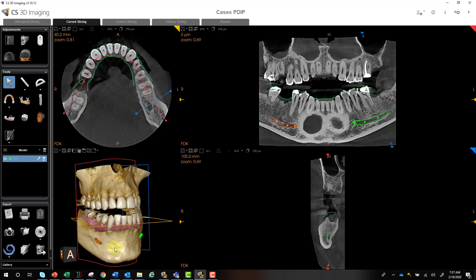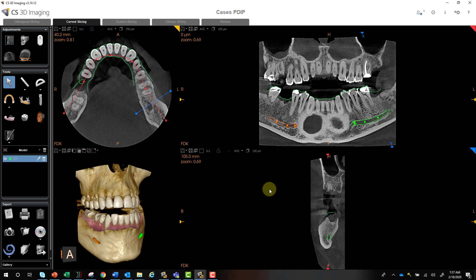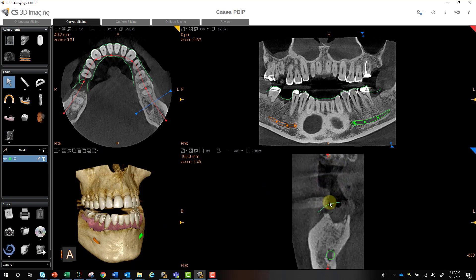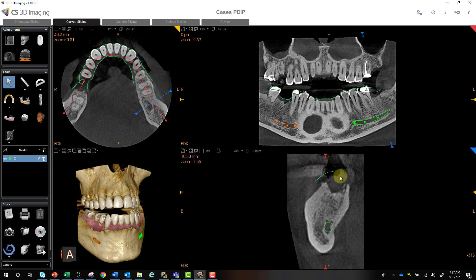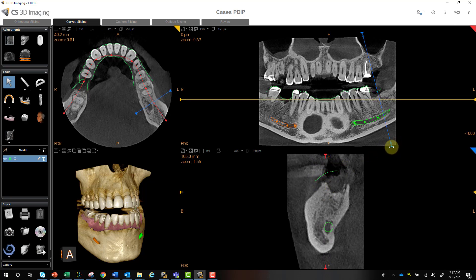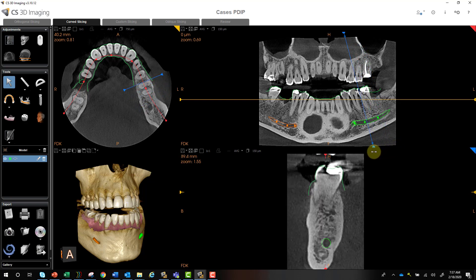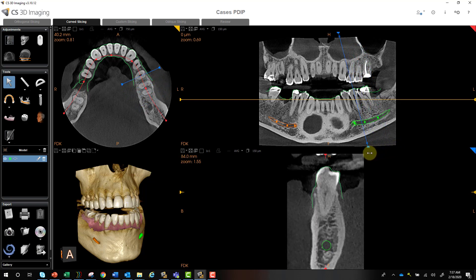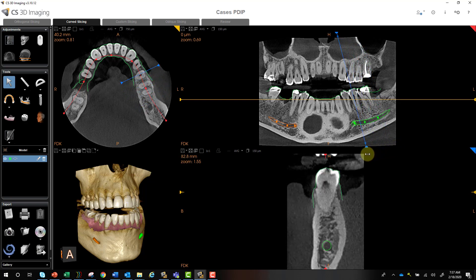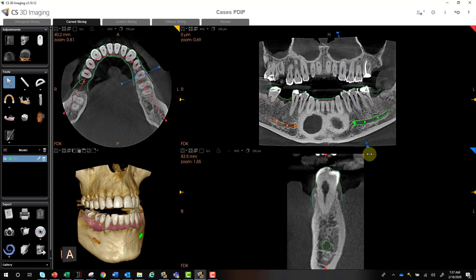The scan is merged, and we can turn off our wireframes here. You can validate the accuracy of the merge by looking at our cross-sectional view — the green is your model that's merged over your CBCT. You can see how it's nicely aligned over the occlusal aspect nice and tight, so that's good.